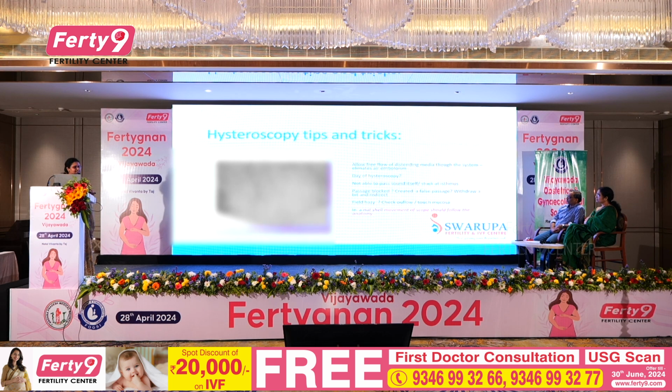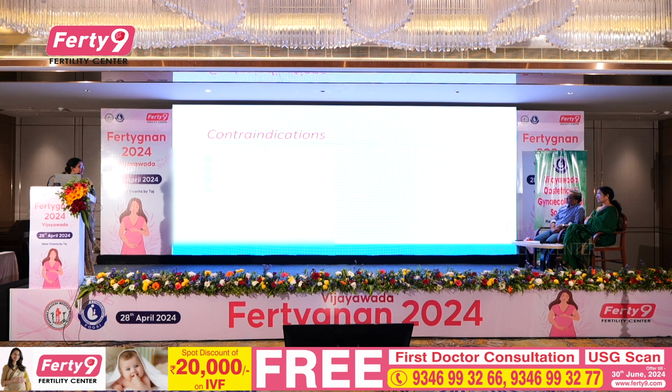And suppose you find that everything is so hazy, just open up the outflow tract. Let some of the fluid go. Then the cavity will be visualized. And sometimes you might have to touch the mucosa so that the camera is visualized properly. In a nutshell, the movement of the hysteroscope should follow the uterine anatomy.